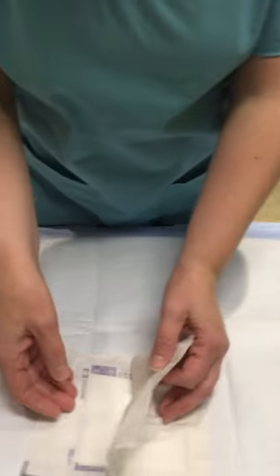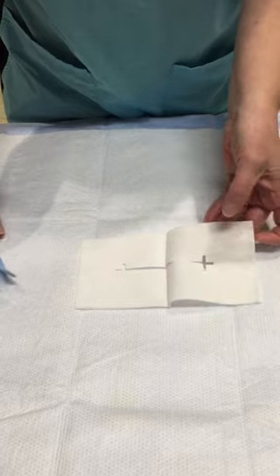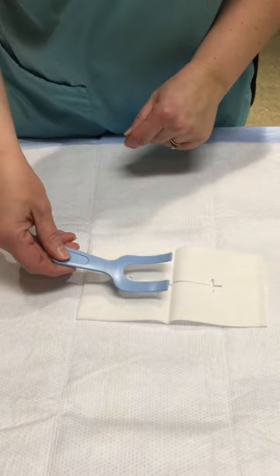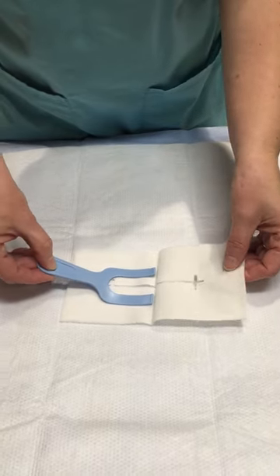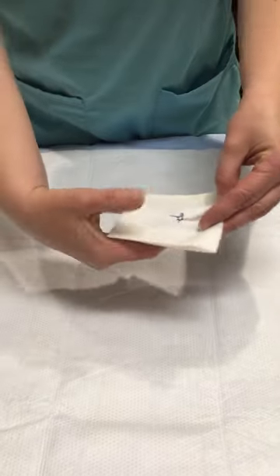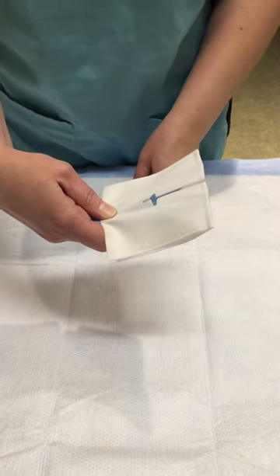you'll be using a split gauze. Notice that the split gauze here is bi-fold. You will be placing the TDA between the layers of the dressing, noticing that it has a thumb groove here. The purpose of the thumb groove is when you put the dressing over the TDA, you'll need to pull the dressing taut so that you have complete control over the dressing.